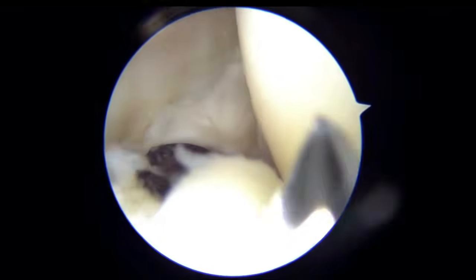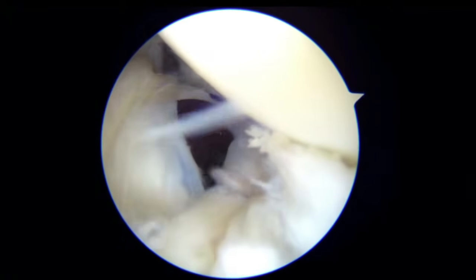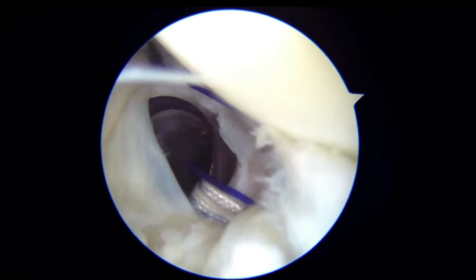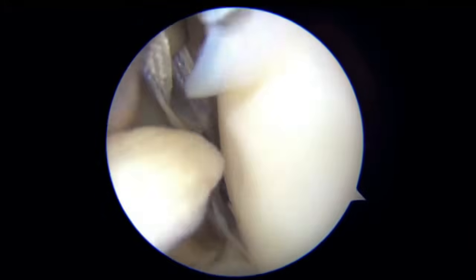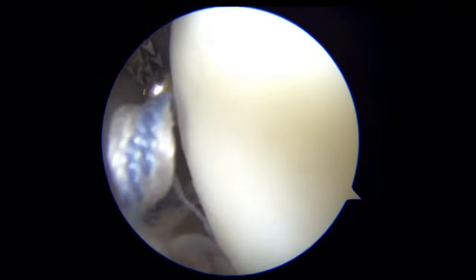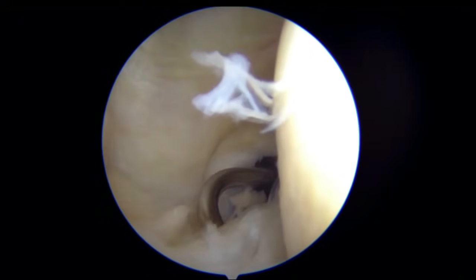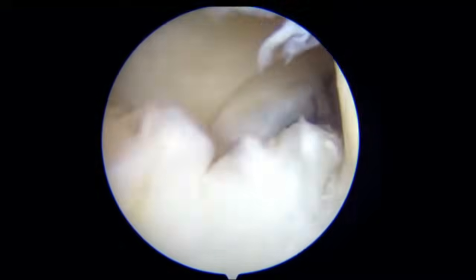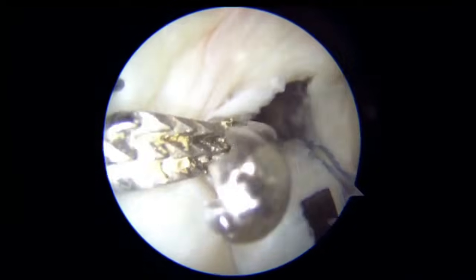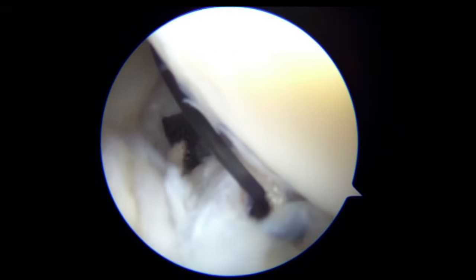I have passed the lasso through one part, and now the lasso is coming out to the second part. I have got a good catch, and now the Prolene suture is coming out and it is being shuttled with fiber tape, and the sutures are being parked in the other portal. And again the suture and the lasso are coming inside for the second suture. And you can see that the lasso has gone through both the pieces of the meniscus, and the nitinol wire is being taken out and the shuttling of the sutures is being done.